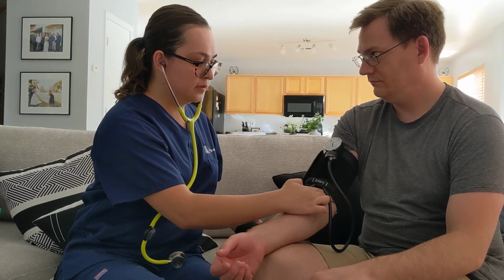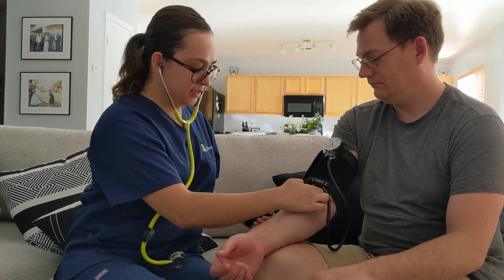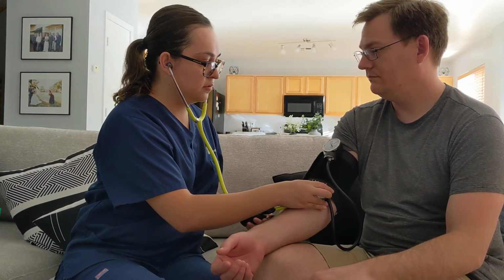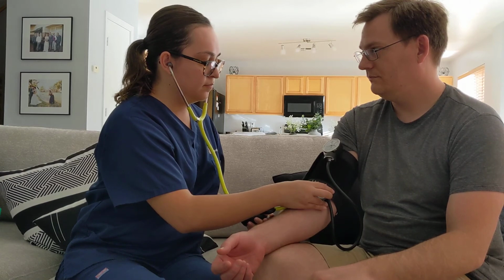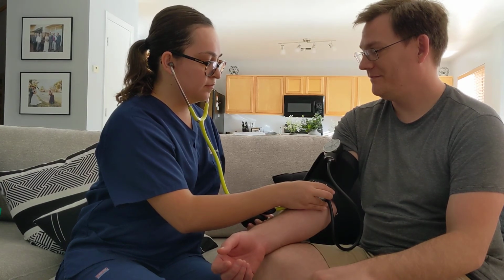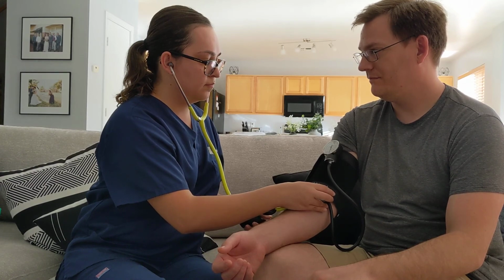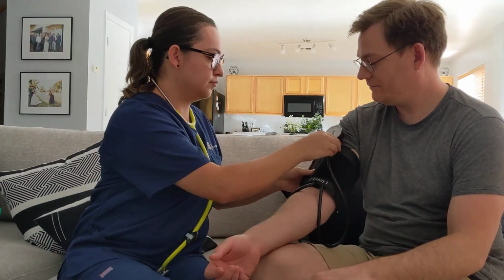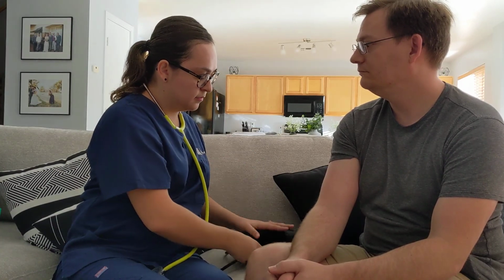Okay, it was 120. So I'm gonna fill it up to 150 and then let it drop by 2 millimeters of mercury at a time. And then I'm gonna listen for the first and the last sound. Perfect, so that was 126 over 80. Other methods to take the blood pressure would be on his forearm and his thigh. Thank you so much. Thank you.